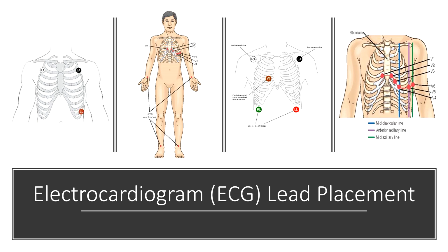When we're talking about EKGs, we're typically talking about a 3 or 5 lead EKG, where it's giving us continuous cardiac monitoring. We can do 12 lead EKGs, where it's giving us a snapshot, because you have all these different leads on your patient. They can't really move around with a 12 lead, but it's telling us what's happening right now. So say your patient's having chest pain, then they would want a 12 lead EKG because then we can have a better view of what's going on.